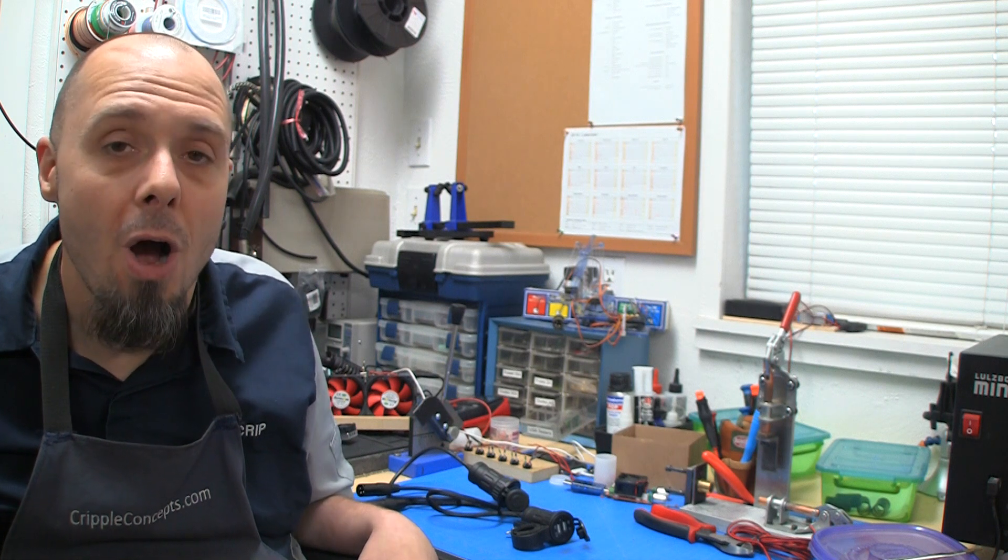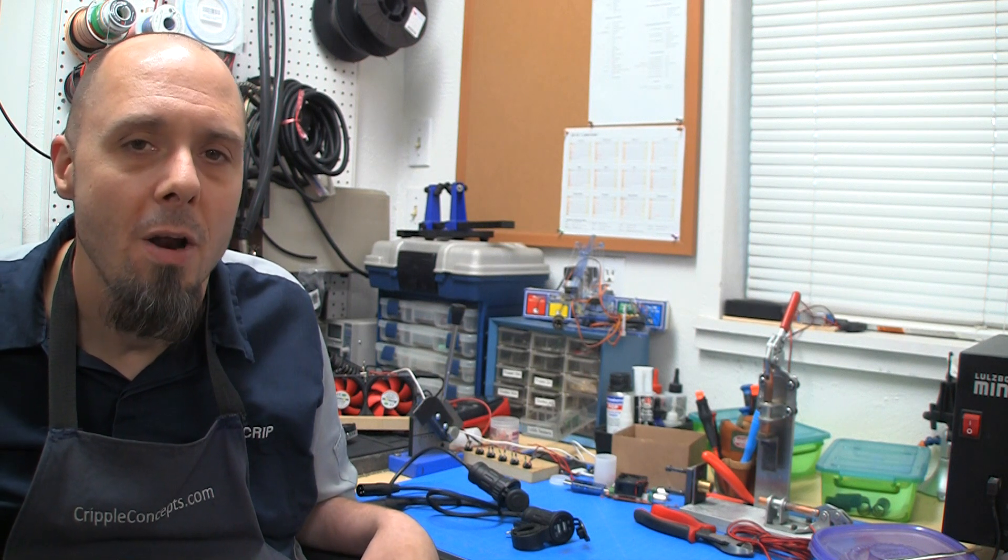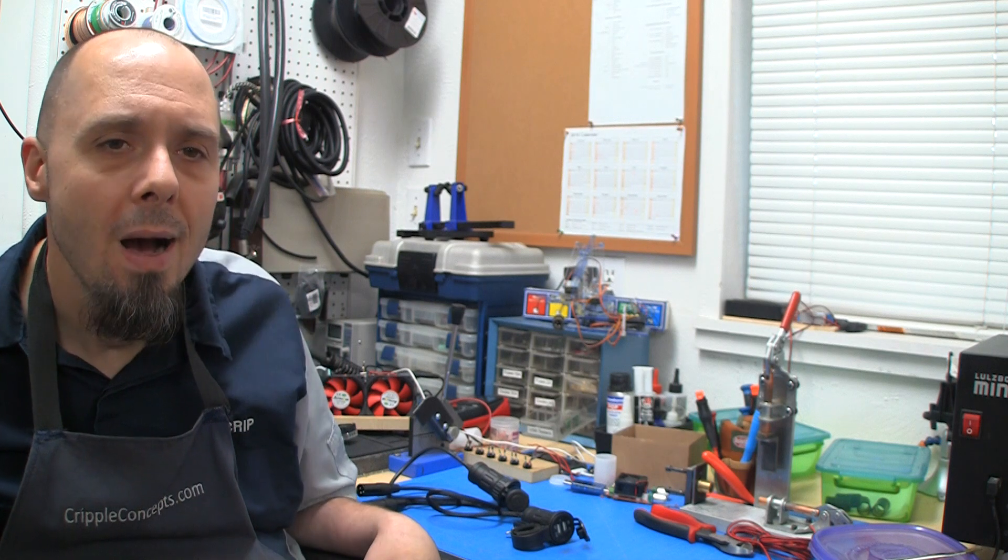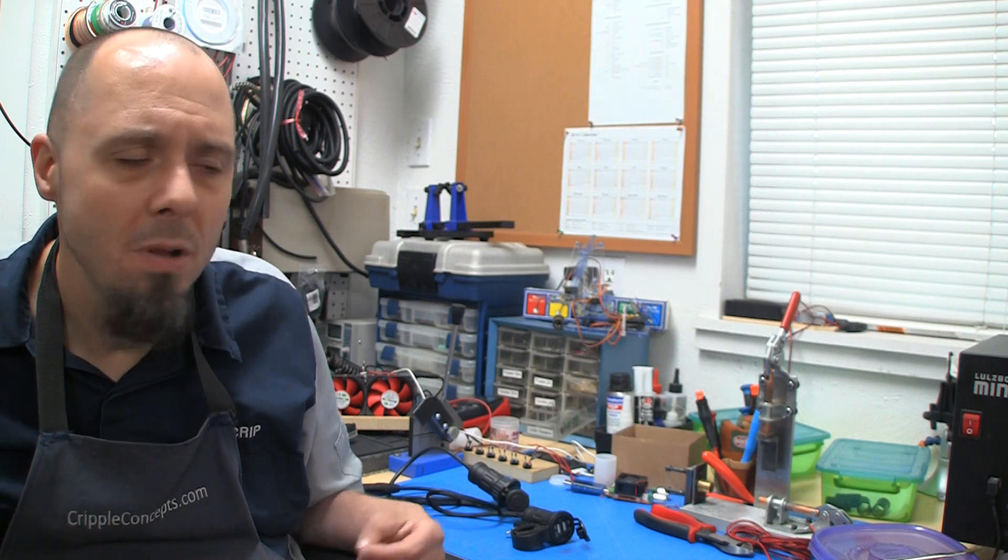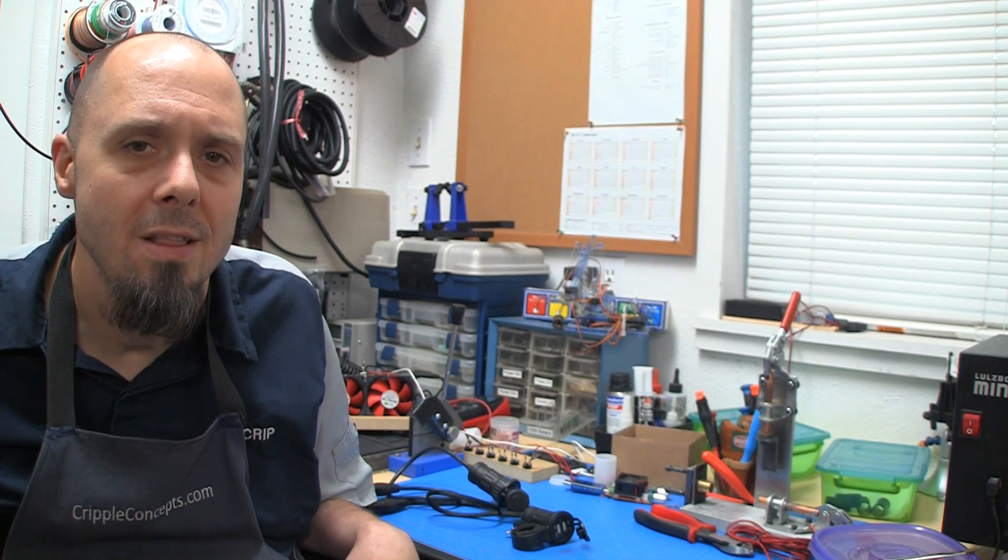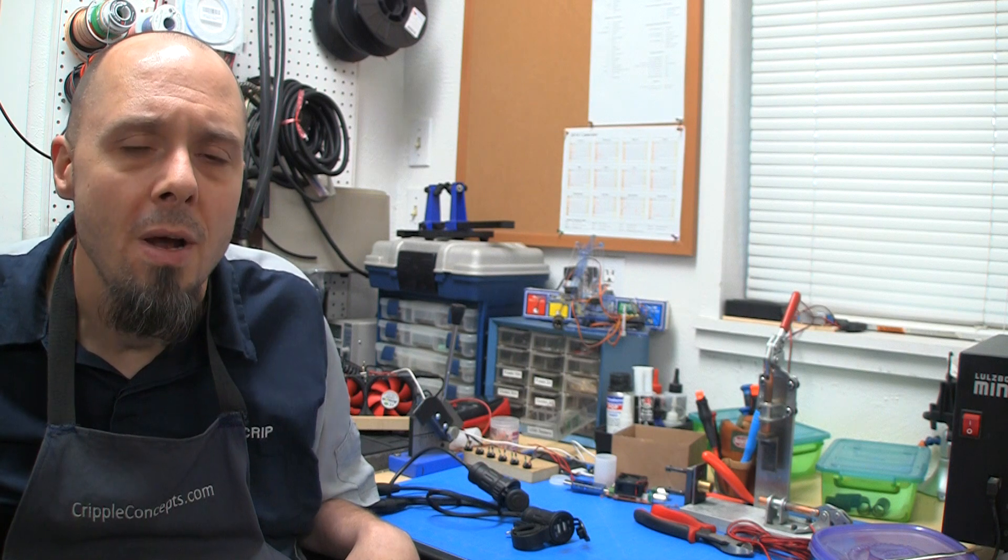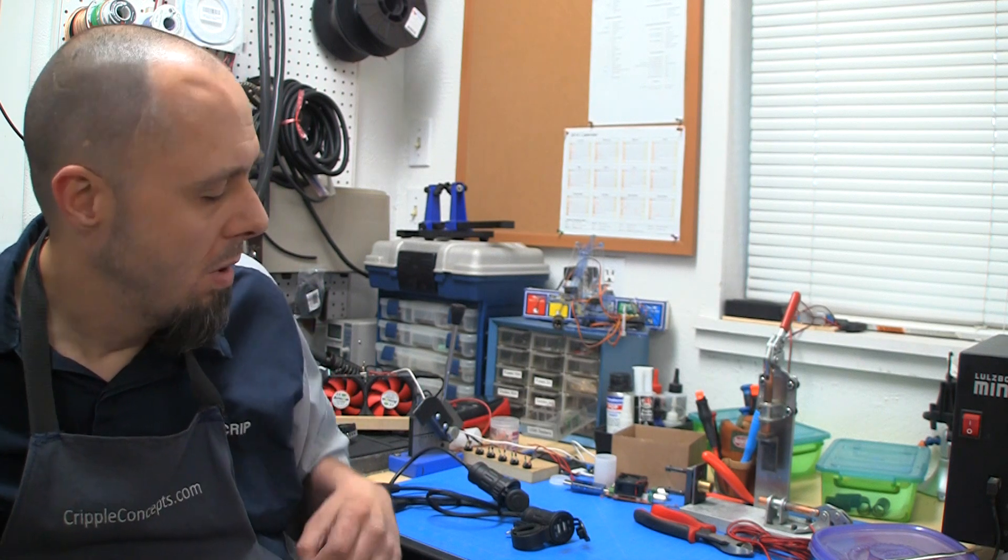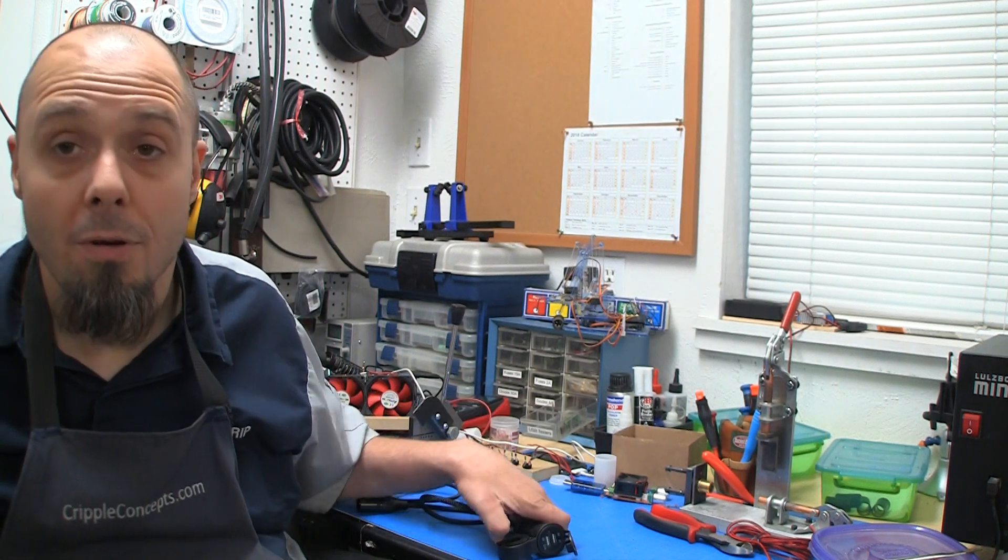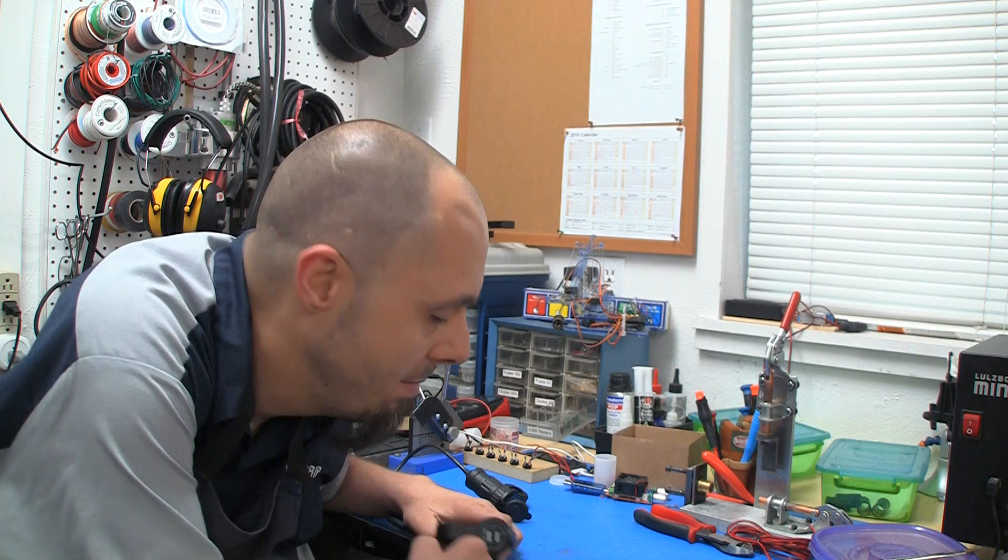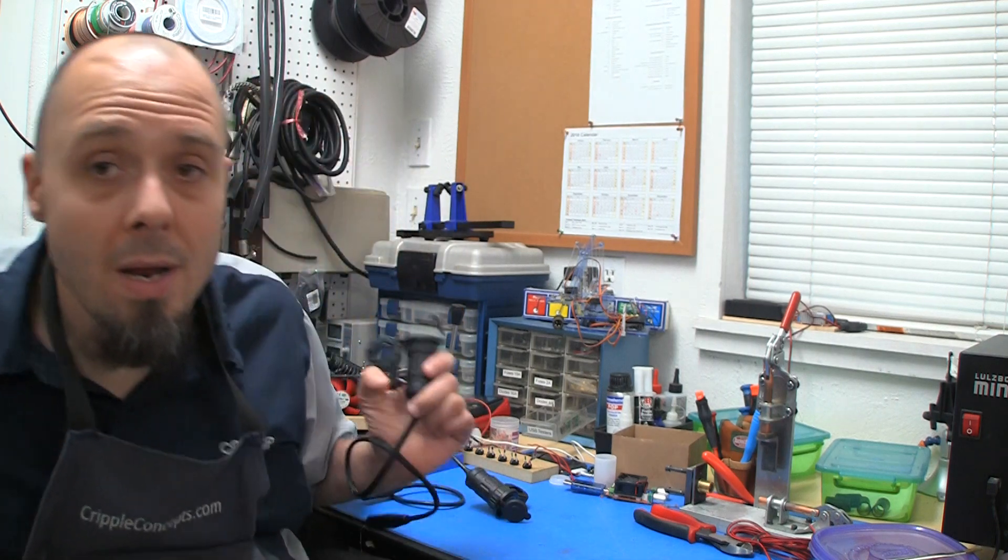A little awkward to be provided a product for free from a competitor to review, but I believe there's a need for a lot of these different chargers on the market, as I said in the last video. Different people have different needs. So, without further delay, let me just get right to it.